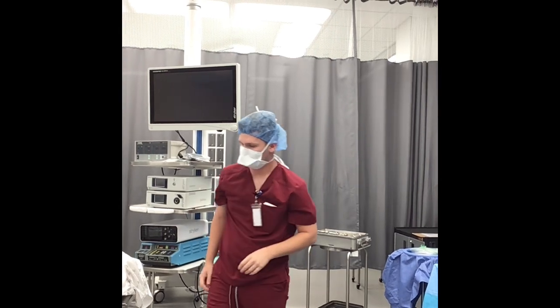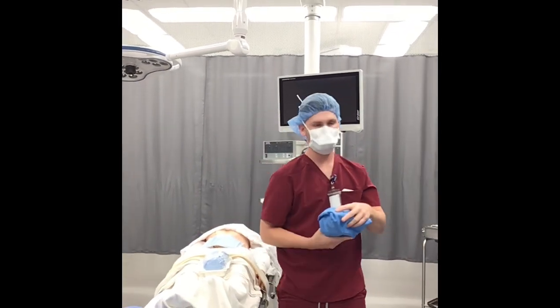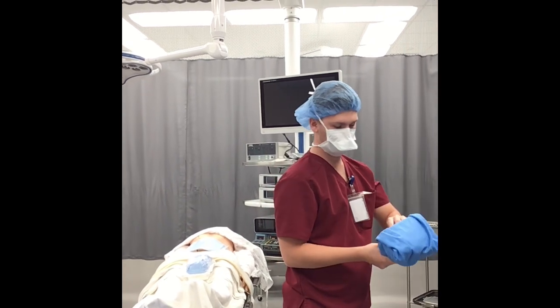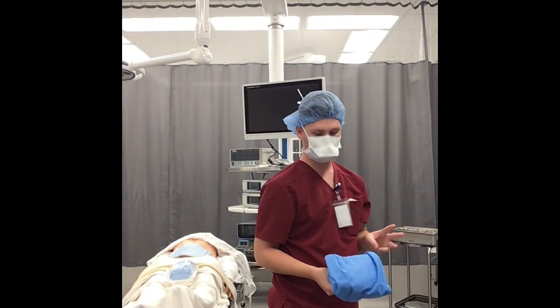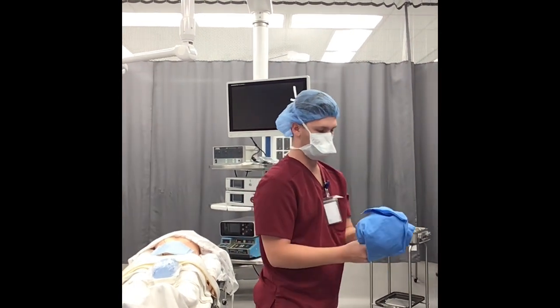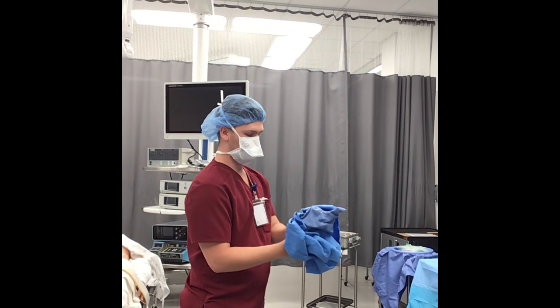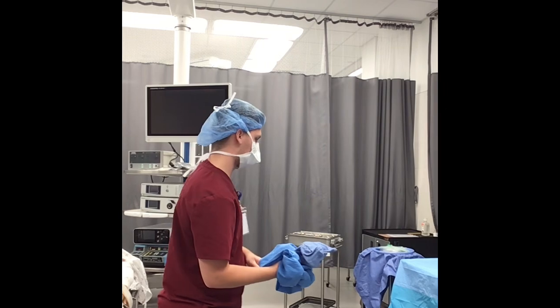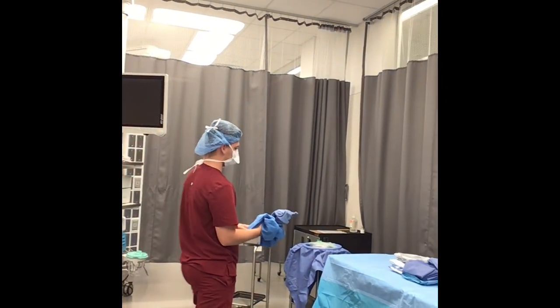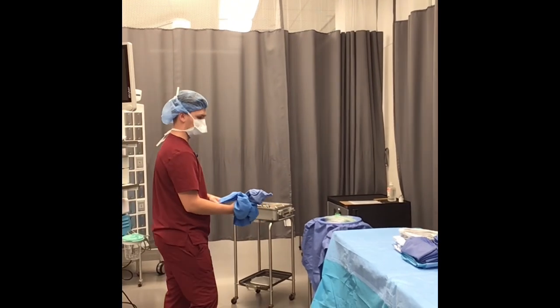Okay, now I can begin opening up all my sterile supplies. It doesn't matter what order you go in, as long as you just get everything open. And you have 3 tries to get all sterile supplies onto the field. So if you miss, not a big deal, everybody misses. Just go ahead, ask your circulator to get a new one, or you can grab one yourself and then keep on opening. Okay? So my light handles, they can either go in my basin or my back table, it doesn't matter. So I'm just going to shoot for my back table.